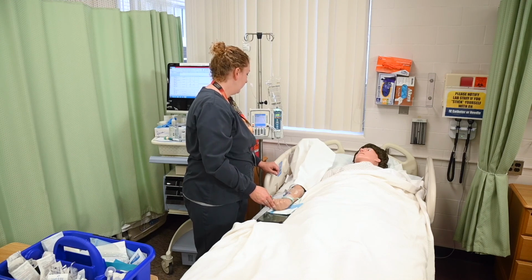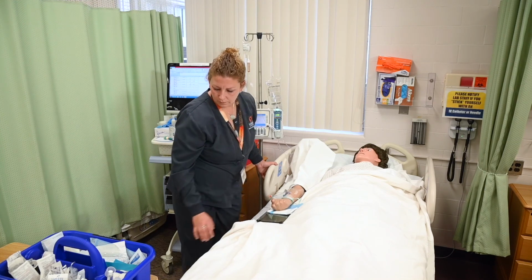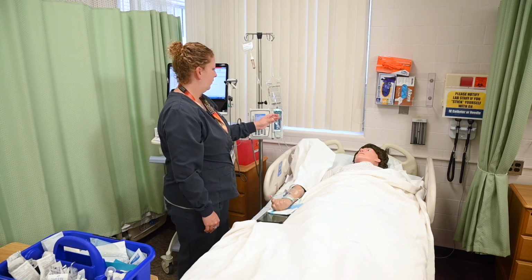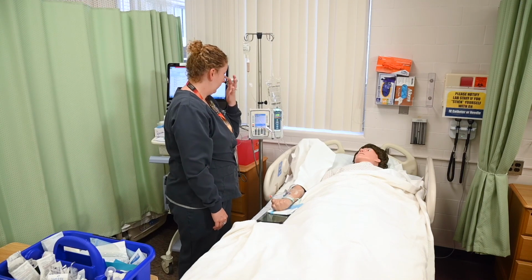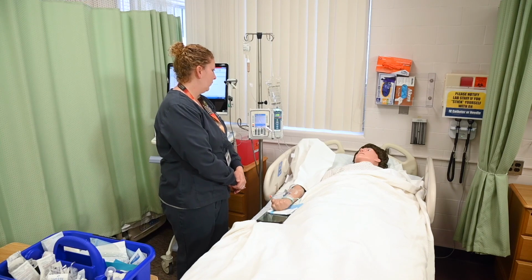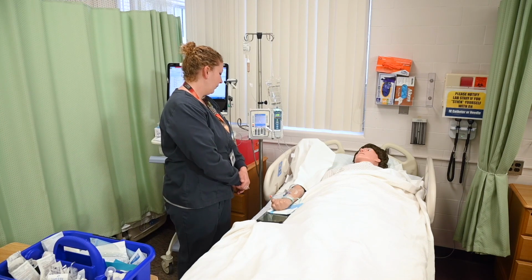Okay, and that really is the end of the scenario here, but you do have some things to do for completion of IV piggyback infusion. All of the following must be stated by the student. Once the IV piggyback is complete, the force of gravity will automatically restart the primary infusion on a continuous IV. Must return to observe the patient, close the roller clamp on the secondary tubing, do not disconnect the tubing.